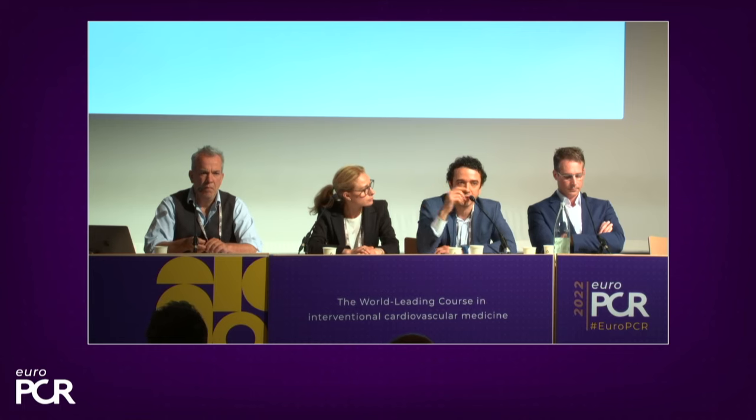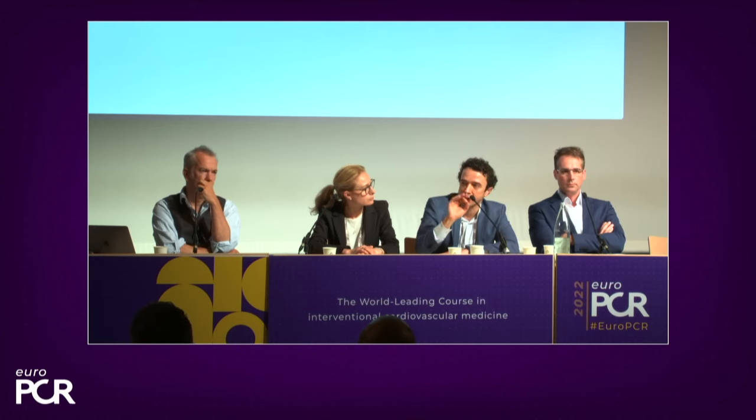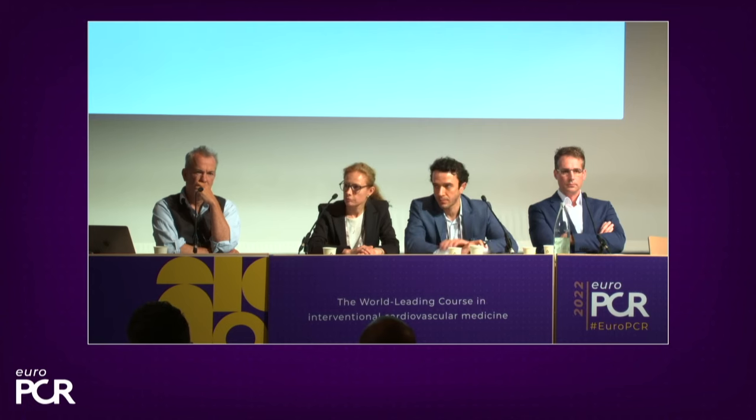We remember the initial era of CoreValve, close to 30% pacemaker rates. So I think we have to really strive to achieve the best possible result for our patients and minimize interaction with the conduction system. When we're doing the procedure, start at halfway through the pigtail, let the valve go down, and minimize the interaction. It's fundamental, and that leads to single-digit pacemaker rates. If we really want to mimic surgical results, that's a very important piece to consider. Yeah, I agree. And you want to minimize the interaction with the LVOT as much as possible.